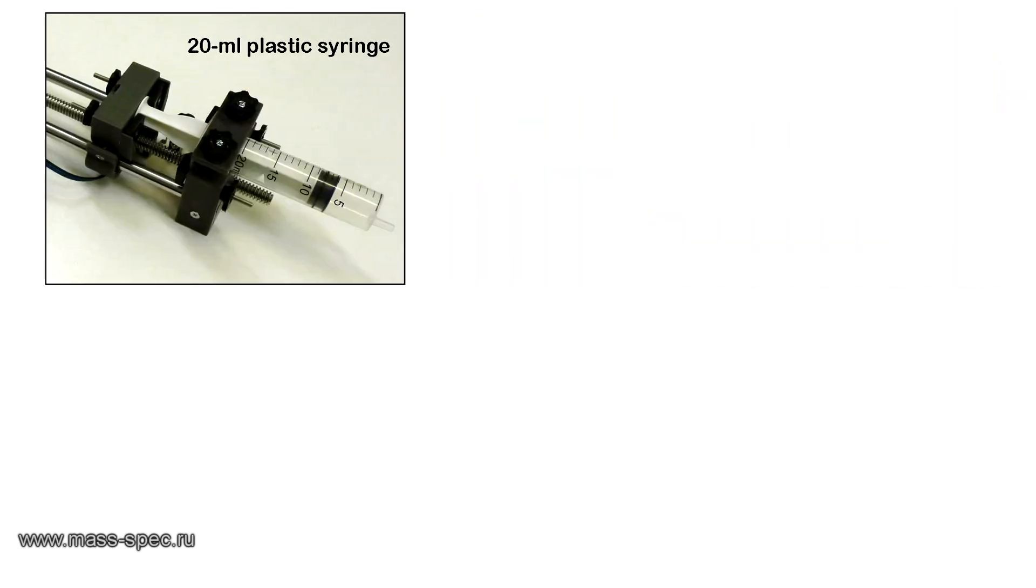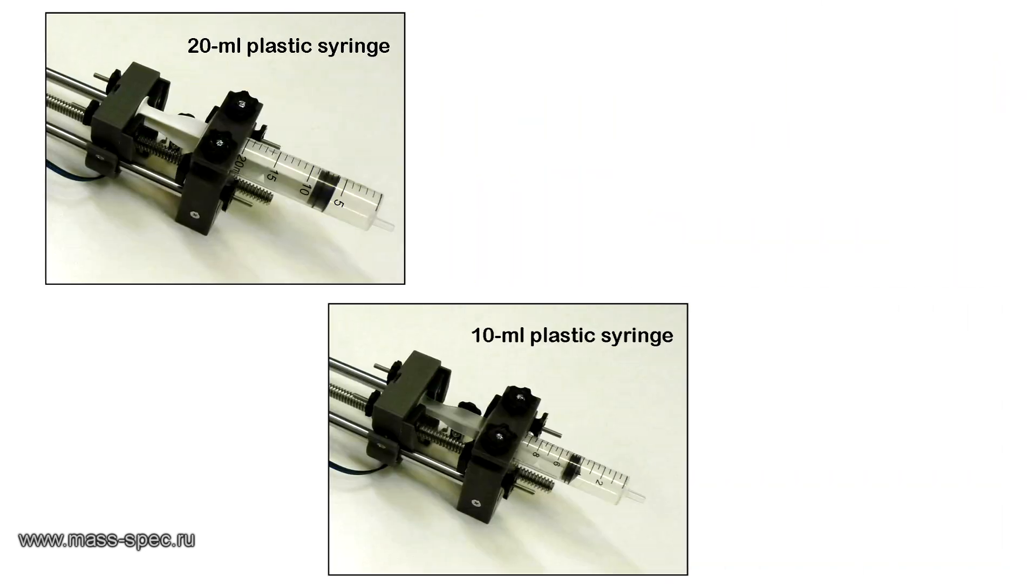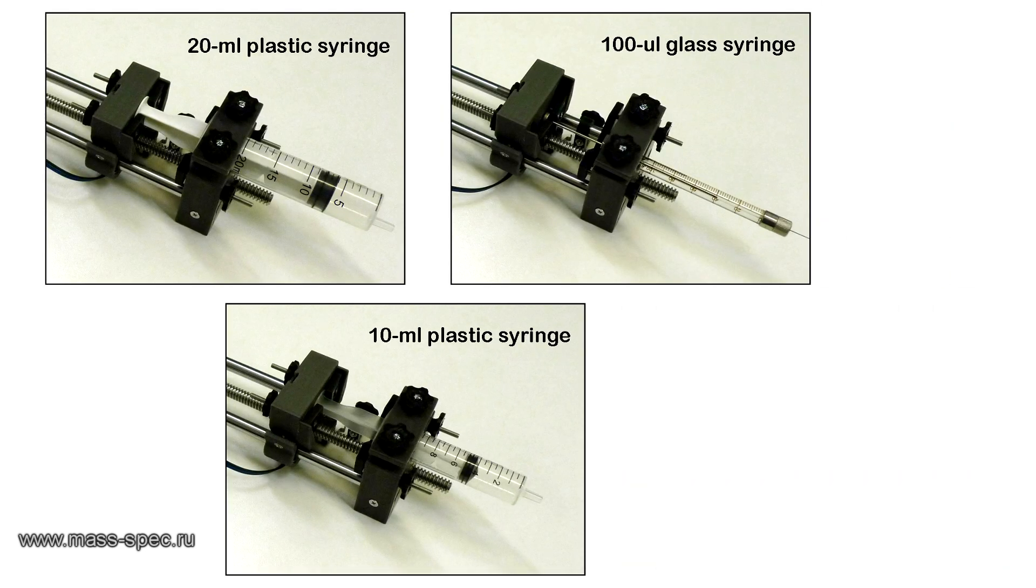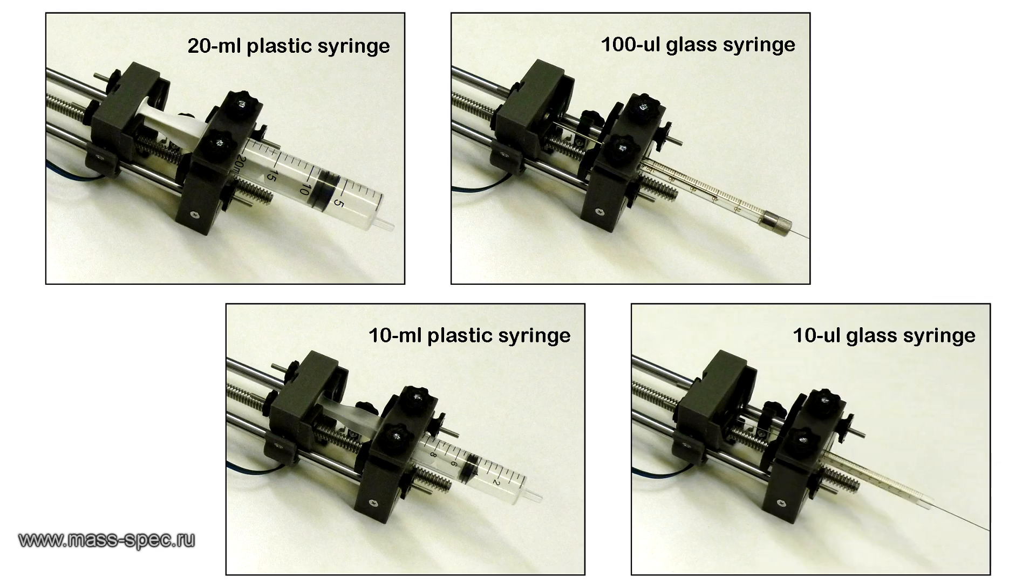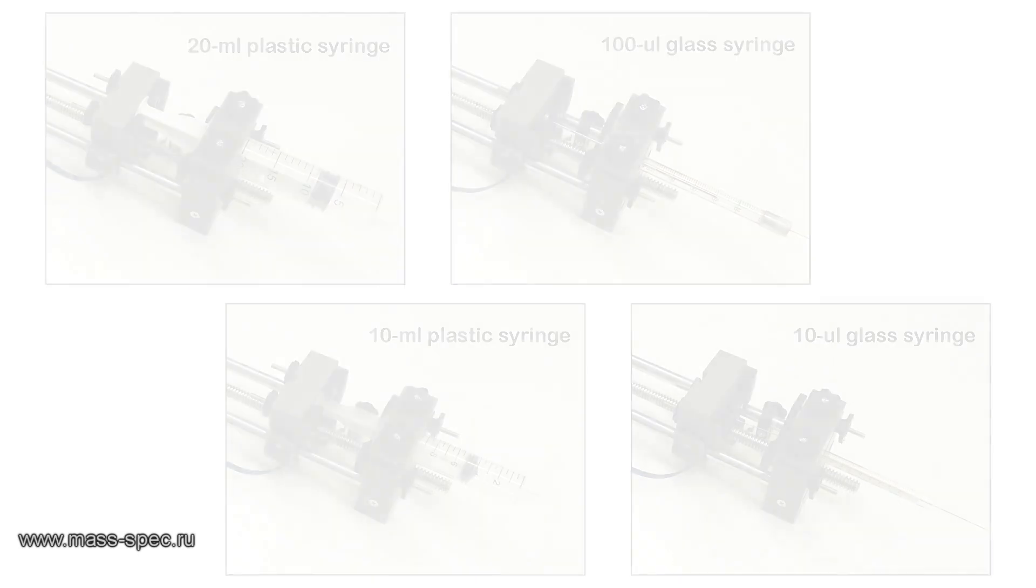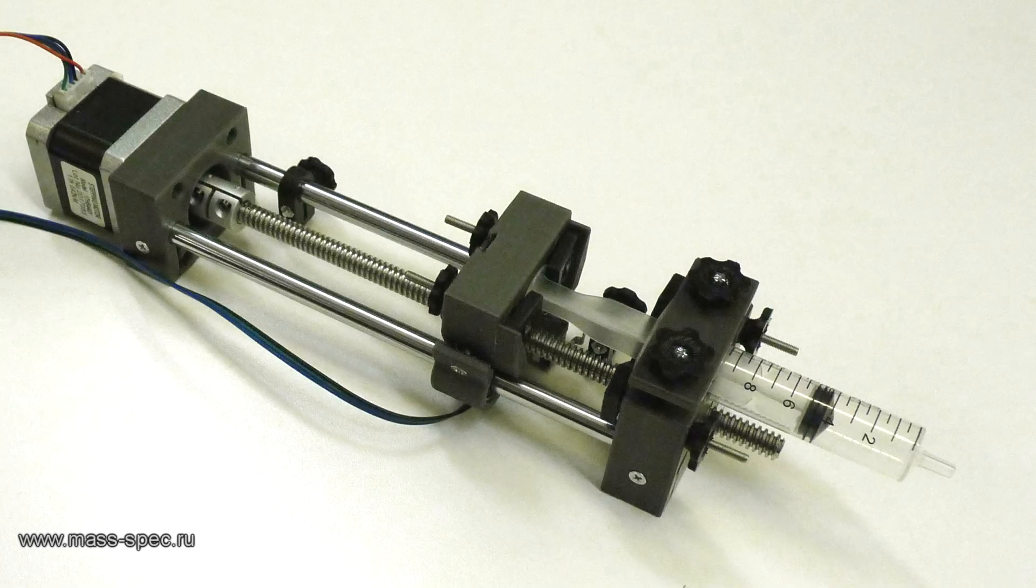The syringe pump has a universal clamp. Various syringes with an outer diameter of up to 25 mm can be installed. In this demonstration a 10 milliliter plastic syringe is used.